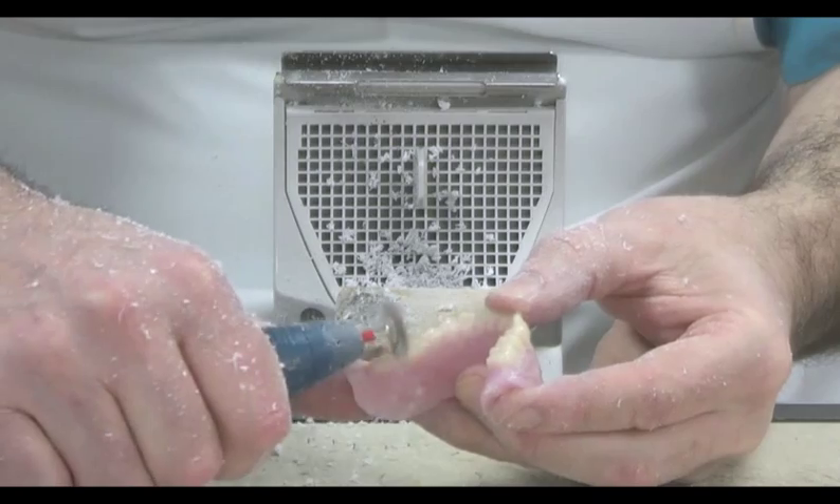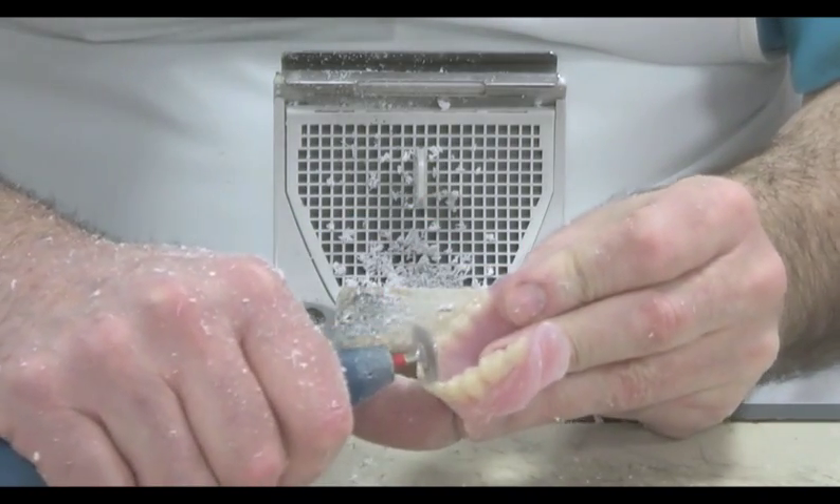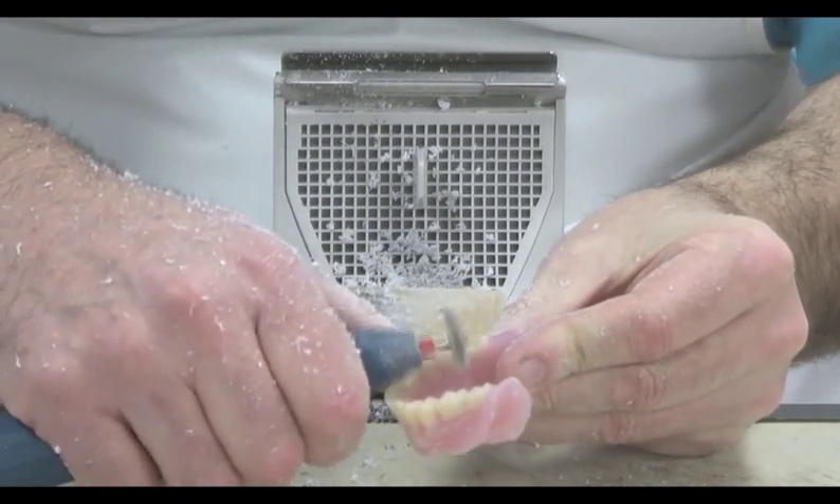Once the rougher edges have been removed, we can smooth it still further using a silicon polisher. This is the equivalent of using sandpaper.